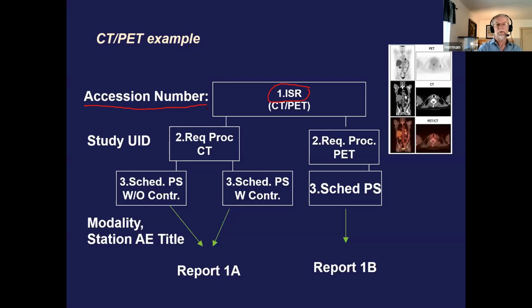And depending a little bit on the modalities, but let's say we have a combo study for PET-CT. The worklist should be able to identify 2 different procedures and should allow the technologist to pick either the CT or the PET procedure, because each one in the worklist should have its own unique study instance identifier, study instance UID. And that's a critical part.